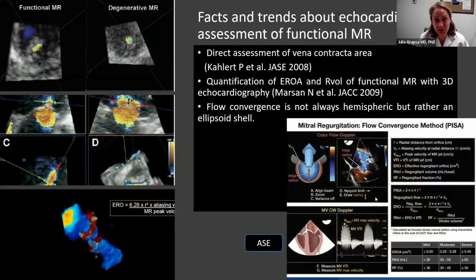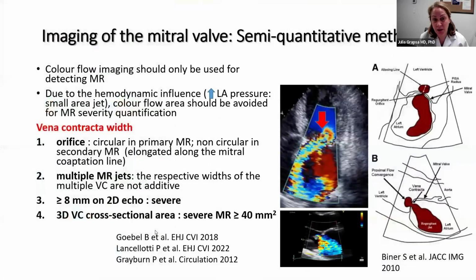It's important to understand the limitations when we assess mitral regurgitation, because when we have multiple jets, and especially an eccentric jet, then the accurate assessment is rather challenging. And many times we will use the 3D vena contracta with multiplanar reconstruction, which seems to have a great sensitivity and specificity to assess the severity of mitral regurgitation.